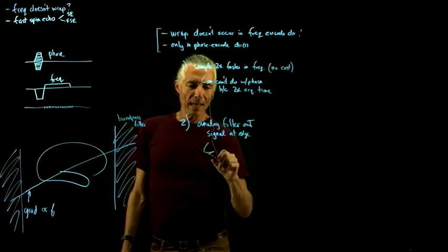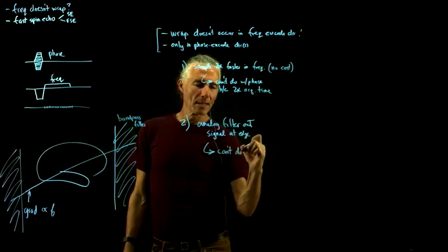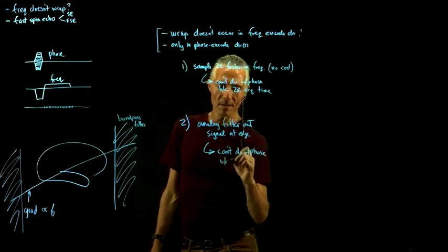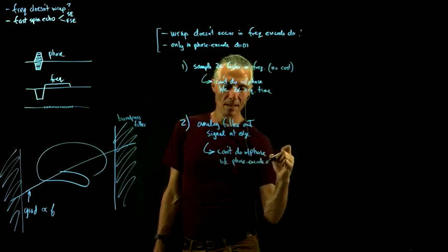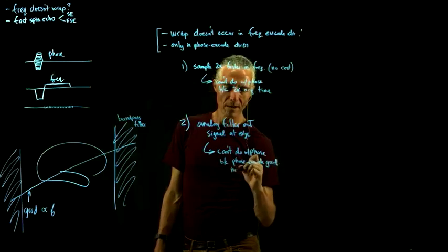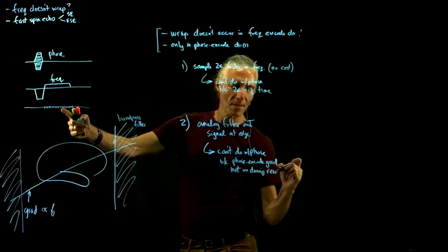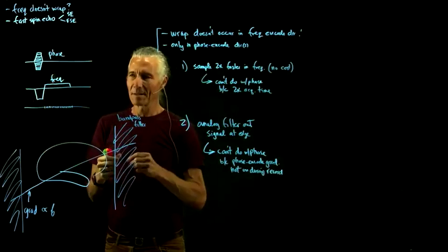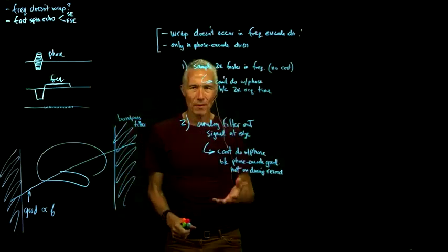And this one, we can't do this one with phase because the gradient isn't on. Because the phase encode gradient isn't on during recording. So when we're doing this recording over here, the frequency encode gradient is on, but the phase encode we just did before, and so we can't do this hack. And so you just have to put up with the wraparound.